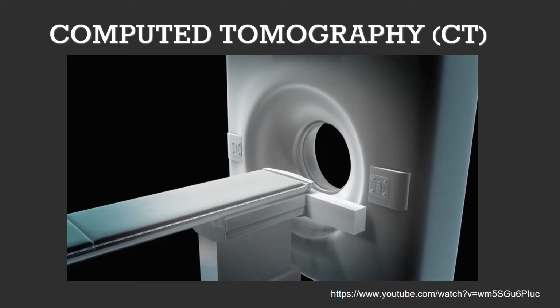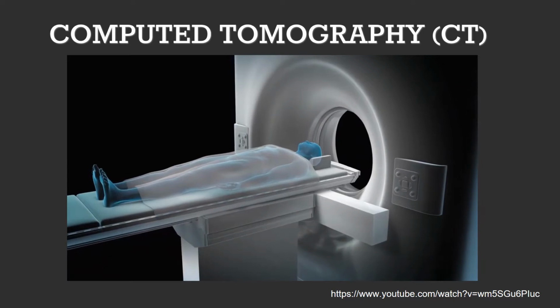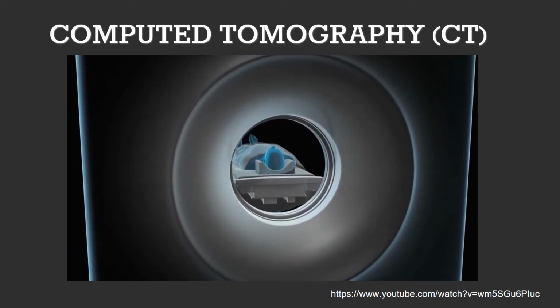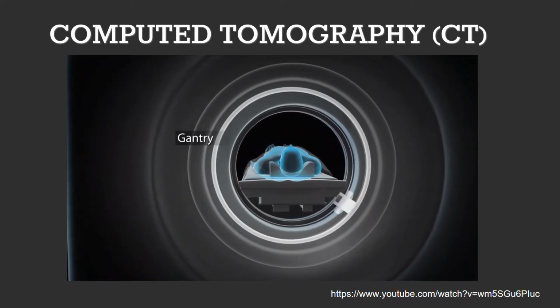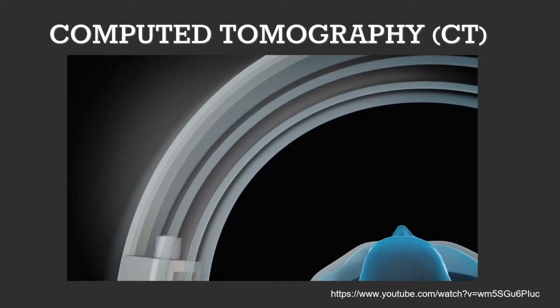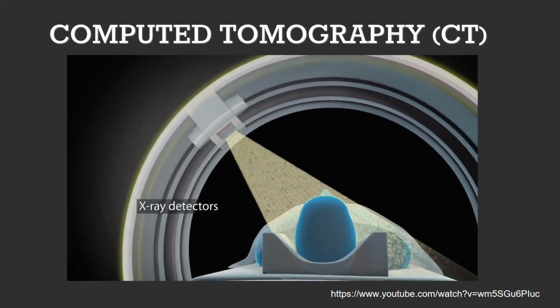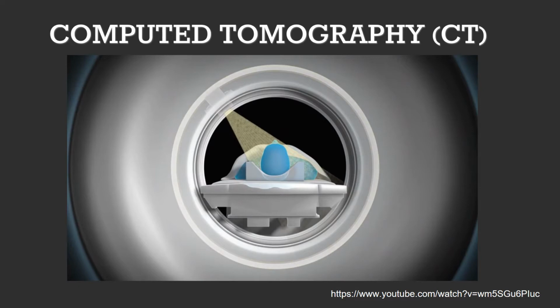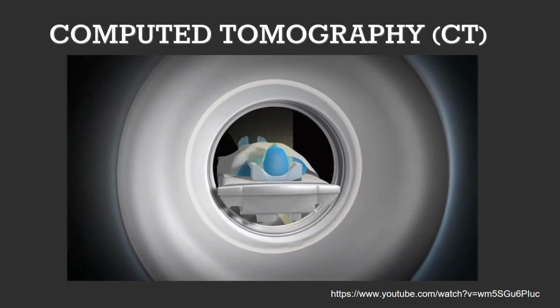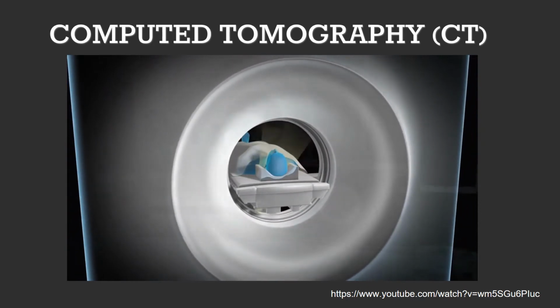A CT scanner is a large X-ray machine with a tunnel in the center. During the scan, the patient lies on a table that passes slowly through the tunnel. The gantry rotates around the body as it passes through. The X-ray tube releases X-ray beams that are transmitted by the body and picked up by special detectors. The beam captures many views of the body from different angles, and the data is sent to computers, which are then translated to 3D images.